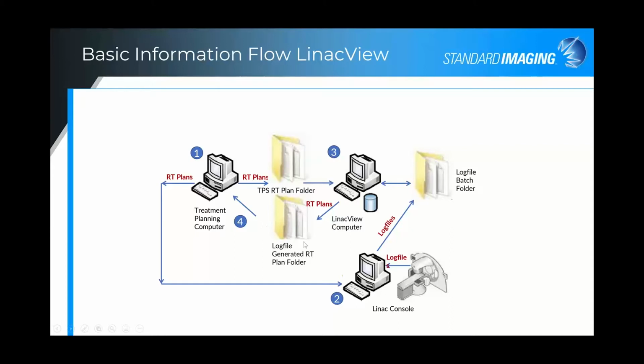And you can then, of course, automate that process to perhaps send it into your treatment planning computer again to recompute there and compare using your familiar and commissioned treatment planning system to compare the planned versus the delivered RT plan.